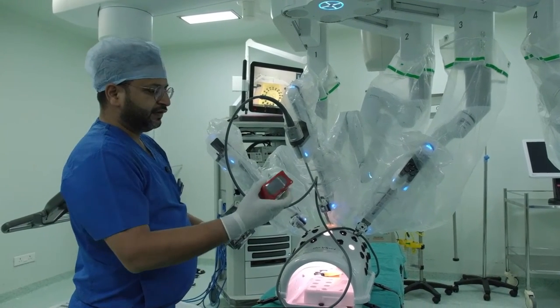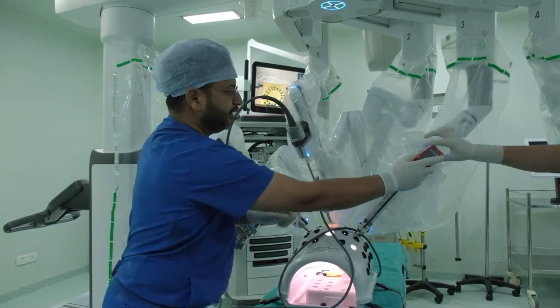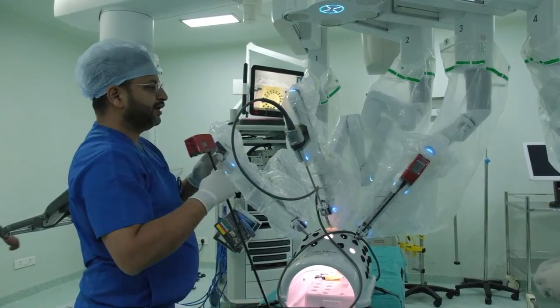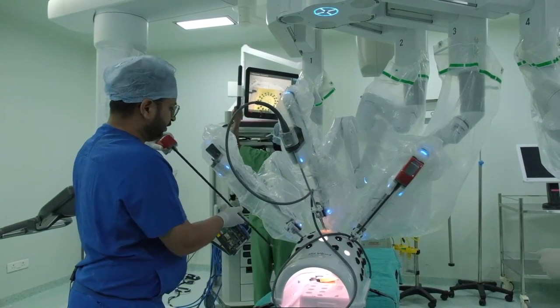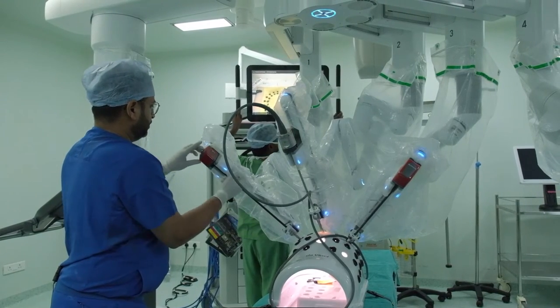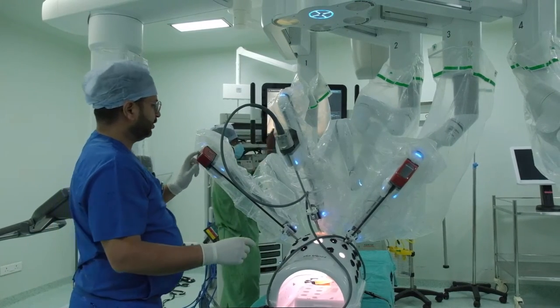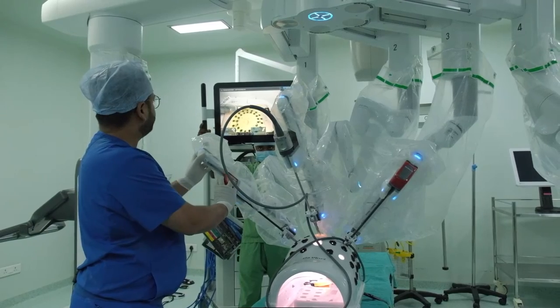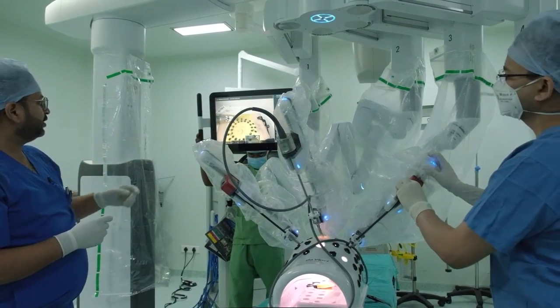So this is a needle driver which we put for the right hand. The instrument is being identified by the machine. As soon as it identifies, the name comes up there, and on the left hand is a Maryland bipolar. So both the instruments are in there. Then we push the instrument clutch and bring the instruments under vision.